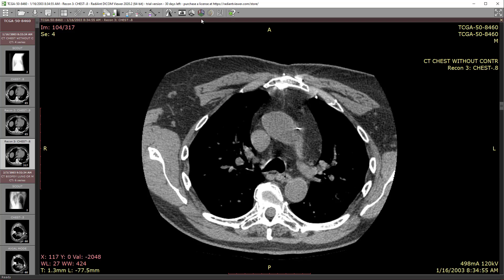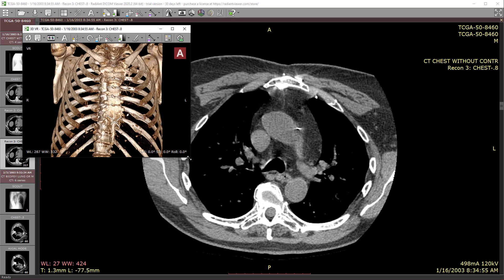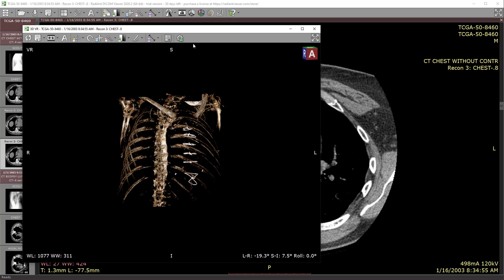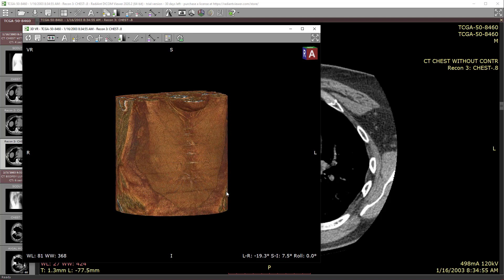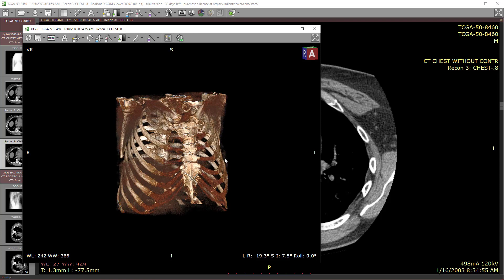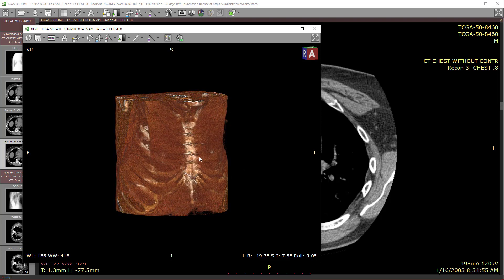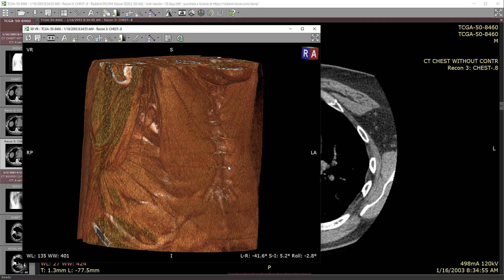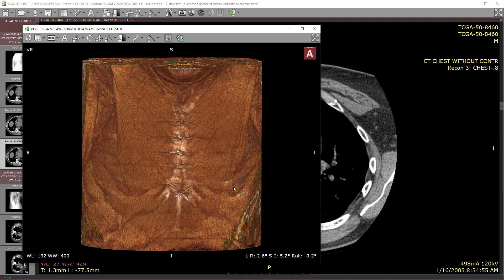Even cooler than that, you can go to the 3D view, make it bigger if you want, and rotate your camera around. Then as you middle-mouse drag you're able to go through the body — all the way through the bones, then the muscles, all the way out to the shirt and skin. If you stop in the bones and muscles you can do a mini dissection through the body with this data.